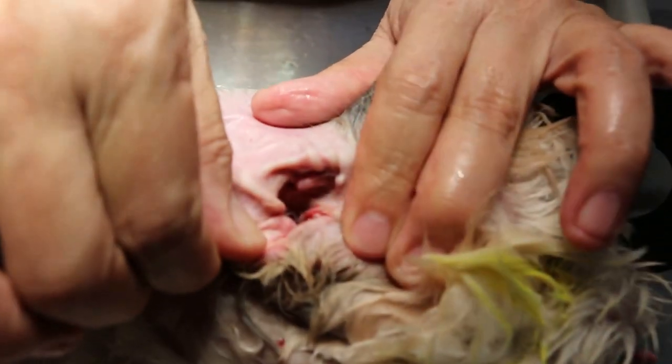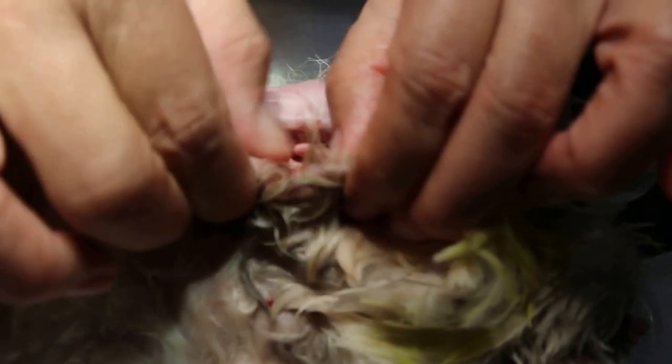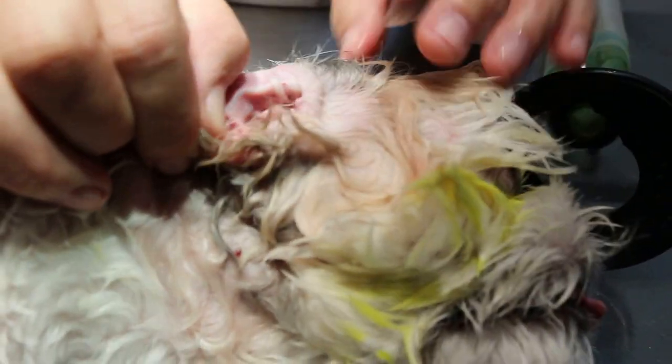I just want to show that the ear has been properly irrigated and there are ulcers there — that's why it is very smelly. And as you can see, the whole area is inflamed.